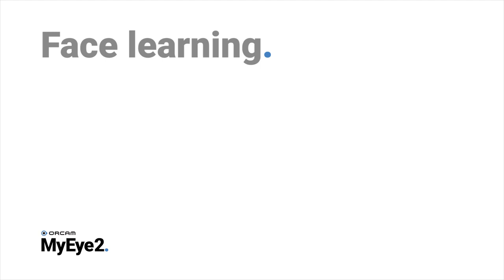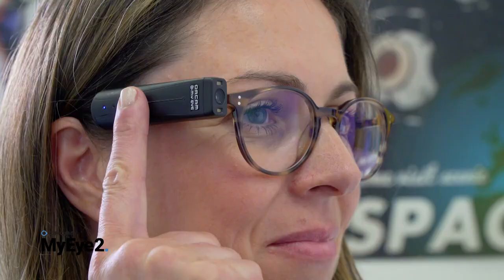You can recognize individuals by teaching your OrCam device the faces of people you often encounter. Please make sure that you position yourself approximately 3 feet or 1 meter away from the person and ask them to face you. Press the touch bar, keeping your finger on it for up to 30 seconds.